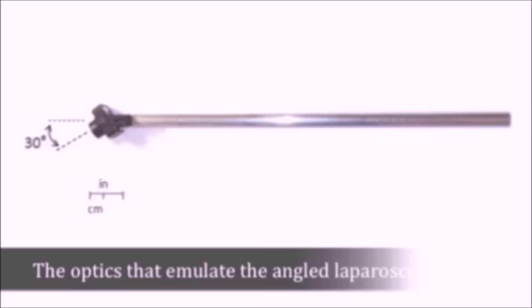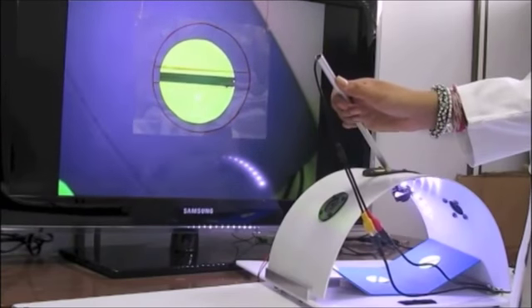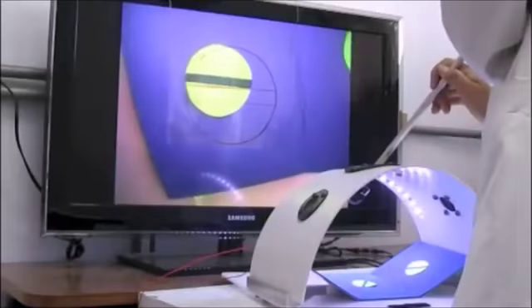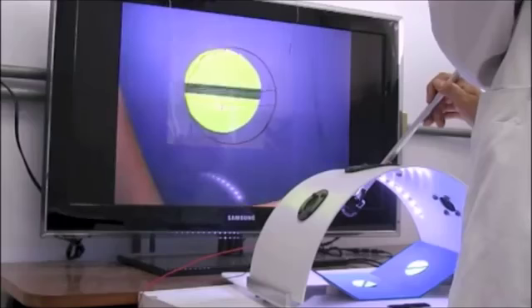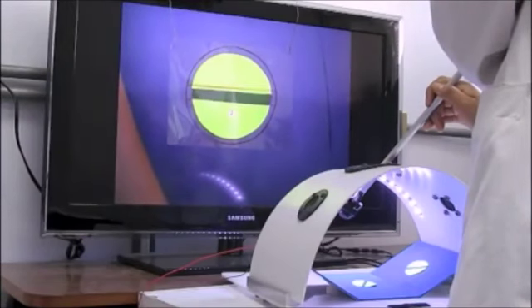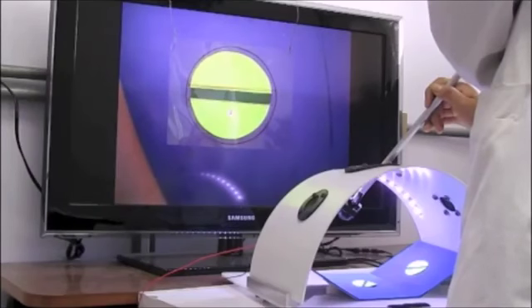In the spatial location task, 3 circular discs are randomly distributed at different angles, that is, 0, 30 and 150 degrees in relation to the horizontal work plane. Each disc has a straight line and is labelled, and the line must be placed within the lines on the monitor and the disc within the circle for 4 seconds.